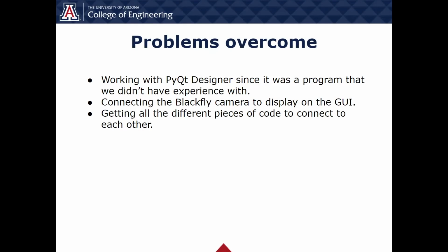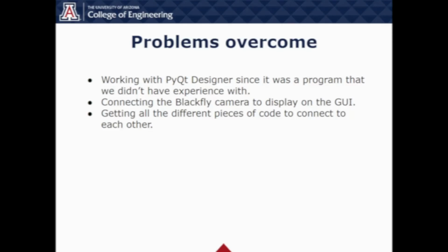Here are some problems our team has overcome. One of them would be working with PyQt Designer, since it was a program that no one really had any experience with. The next one was connecting the Blackfly camera to display on the GUI instead of opening up in a new window. And another problem that we overcame was getting all the different pieces of code, like the blood quantization and the data binning, to connect to each other.